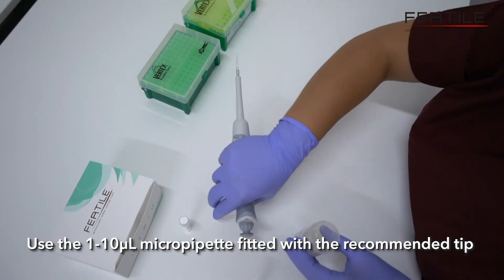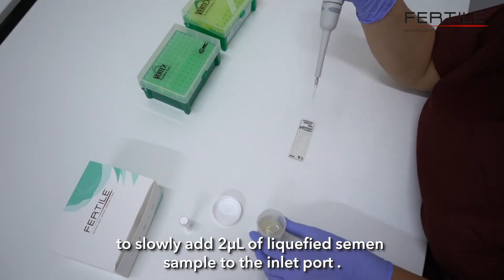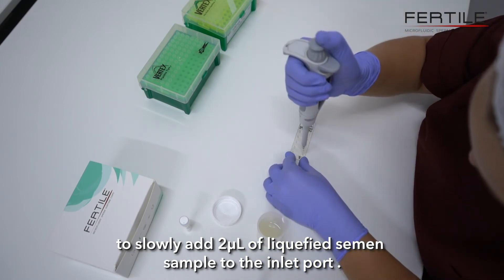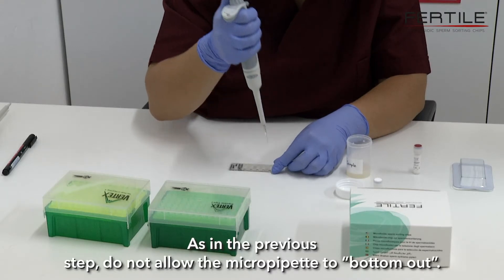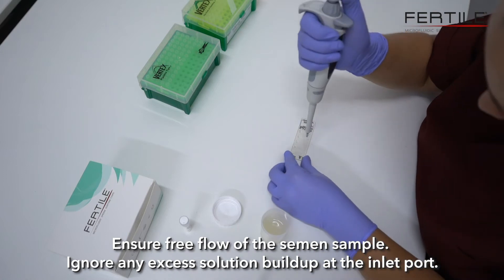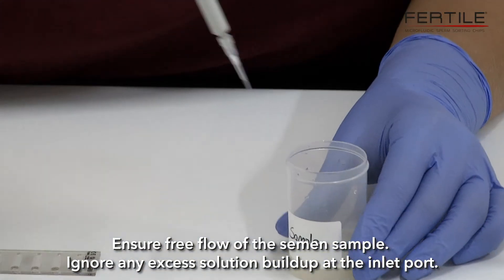Use the 1–10 µL micropipette fitted with the recommended tip to slowly add 2 µL of liquefied semen sample to the inlet port. As in the previous step, do not allow the micropipette to bottom out. Ensure free flow of the semen sample. Ignore any excess solution buildup at the inlet port.